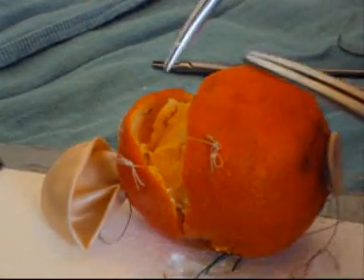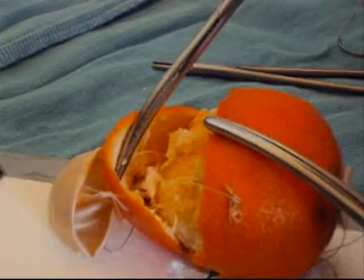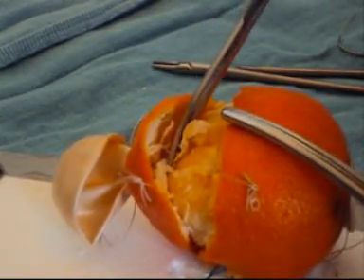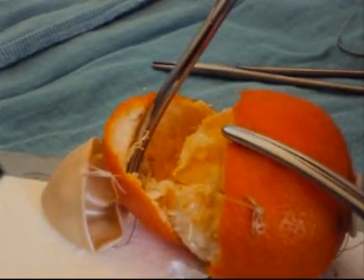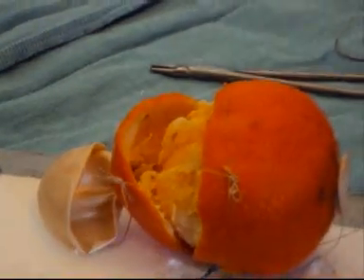The beauty of the more advanced model using the balloon is that when we dissect down, we can formally see the urethra on stretch, as it happens in real life, and we can formally cut through the urethra with the Metzenbaum scissors as one would do in the actual operation. This is an essential teaching point.